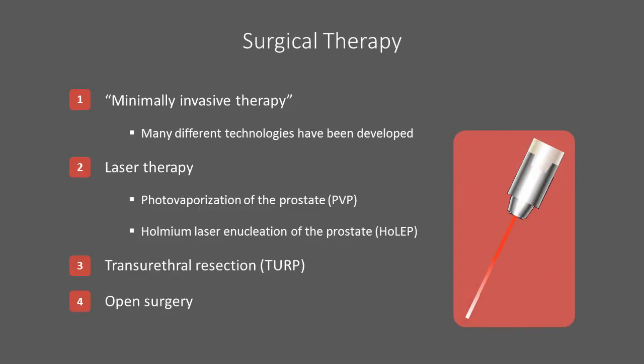This slide gives you some of the many surgical options that your surgeon has to choose from. Many different so-called minimally invasive procedures have been developed, but none of them to date are mainstream. Standard surgical therapies range from laser therapies to transurethral resection and finally to open surgery.